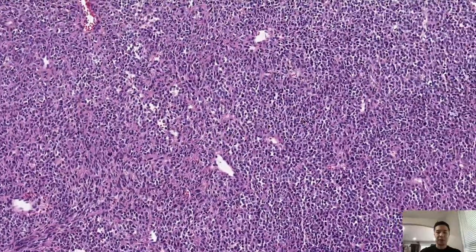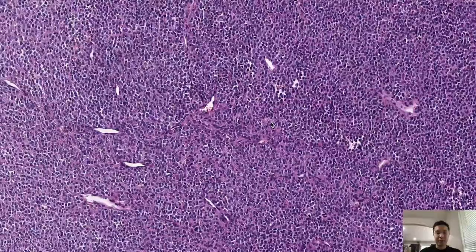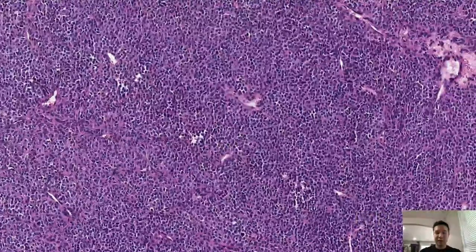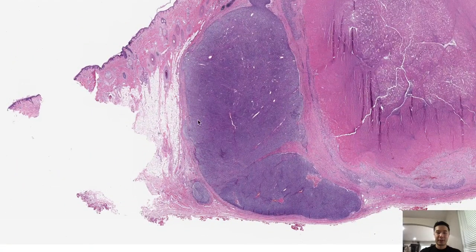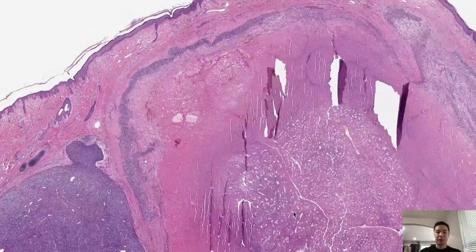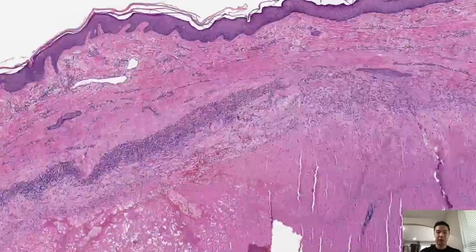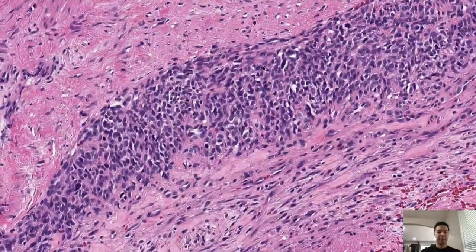Here, I'm not 100% sure if this is the cancer in a lymph node, or a solid tumor of epithelioid sarcoma, or if this is just a reactive lymph node, to be honest. Maybe this is the early stages of epithelioid sarcoma before it outgrows its blood supply and there's necrosis. But typically for epithelioid sarcoma, you'll have this necrotizing granuloma with atypical cells that are palisading. What else was I going to say?